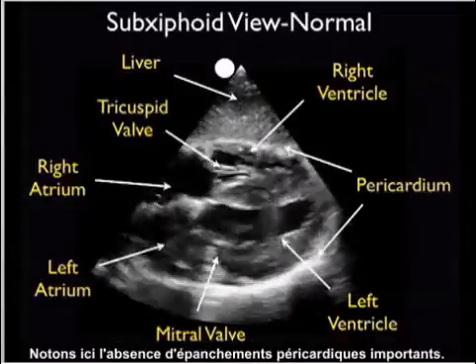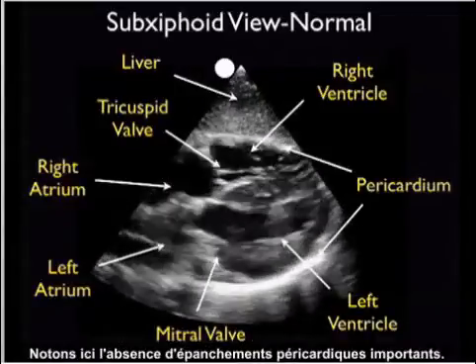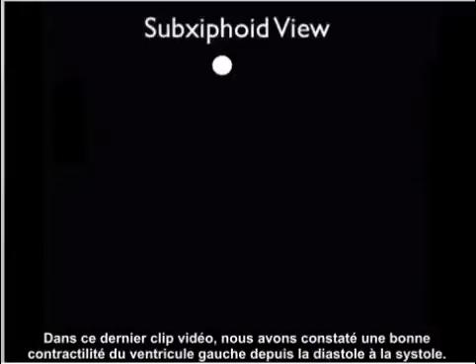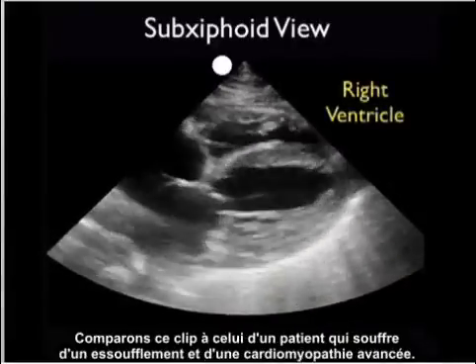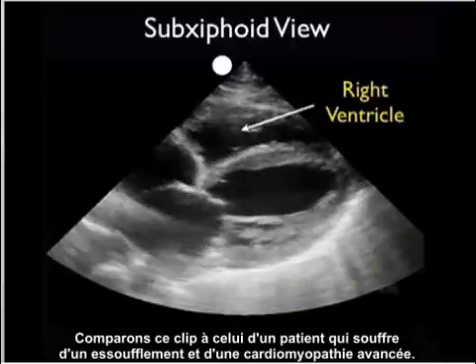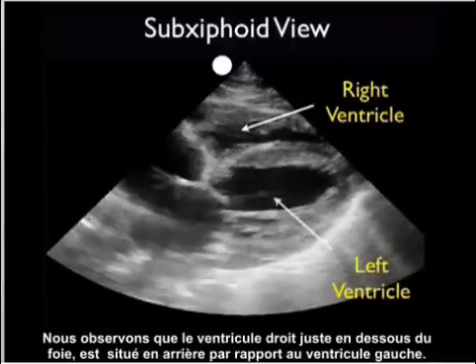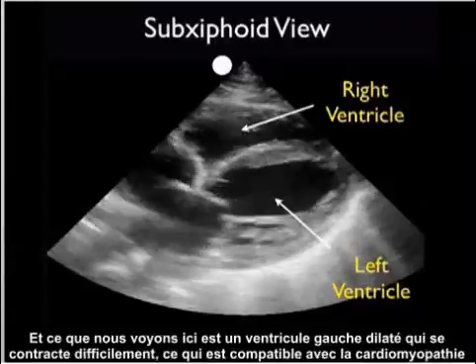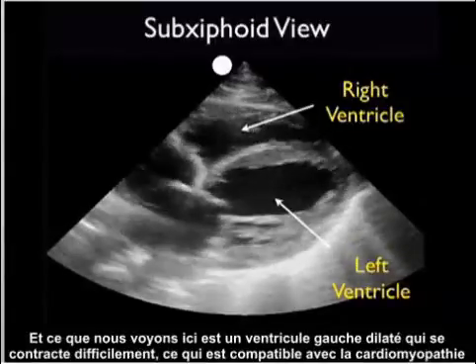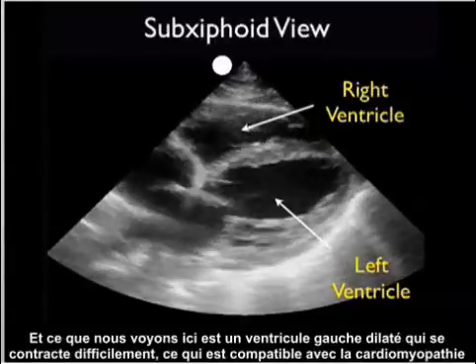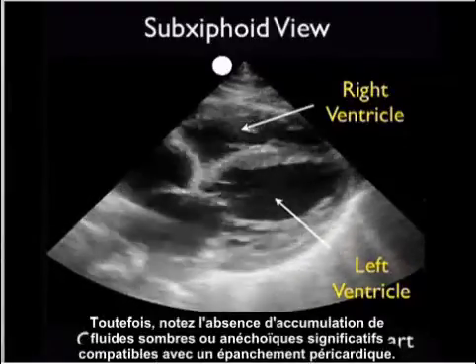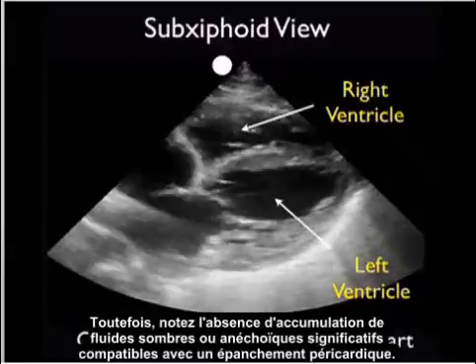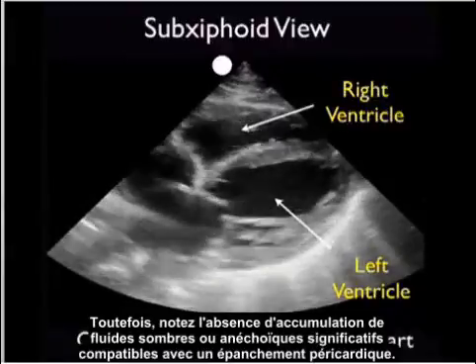Note the absence of any significant pericardial effusions in that clip. We also noted good contractility of the left ventricle from diastole to systole. Let's contrast that clip to this one from a patient who presented with shortness of breath and advanced cardiomyopathy. We see the right ventricle just below the liver, anterior to the left ventricle. What we see here is a poorly contracting and dilated left ventricle consistent with a cardiomyopathy heart. However, note the absence of any significant dark or anechoic fluid collections consistent with a pericardial effusion.